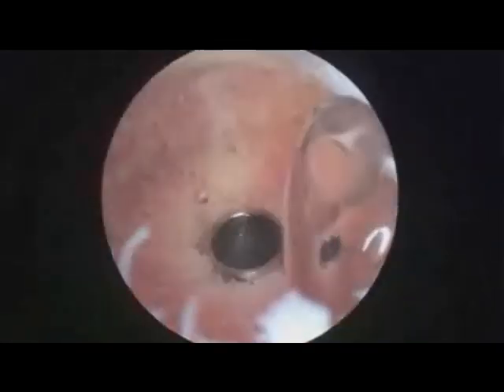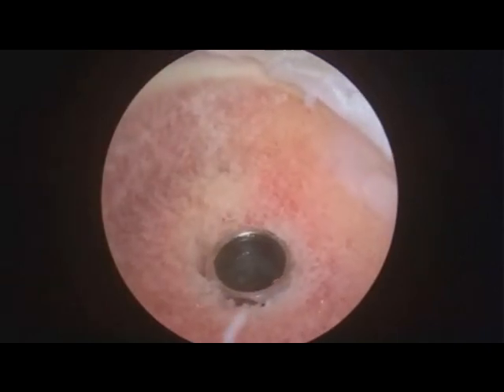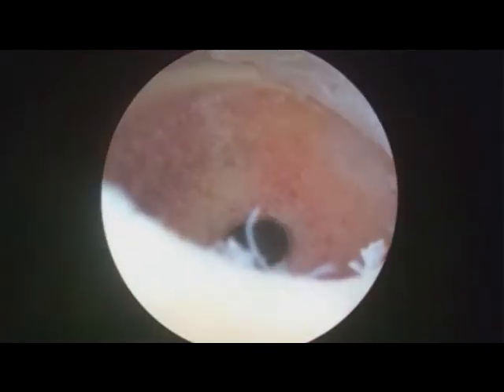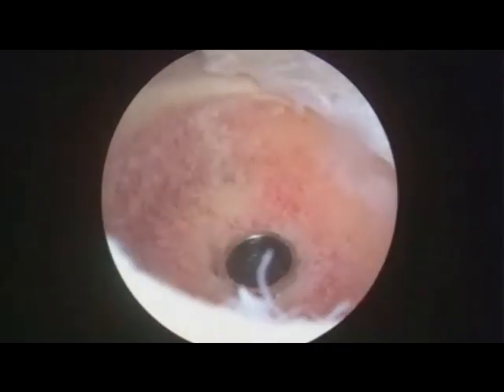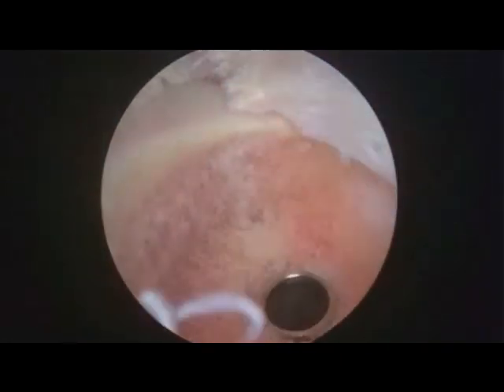So now it's basically just simple arthroscopic techniques that we use. You see the screw is still in position. We're going to leave that in place, and we're going to cement this at the end of the procedure, but we're not going to do it now. So what I do now is just hold the scope here, please, and give us an inside-outside view.